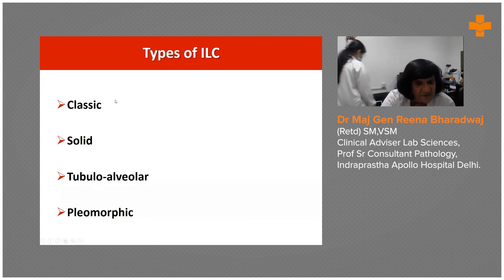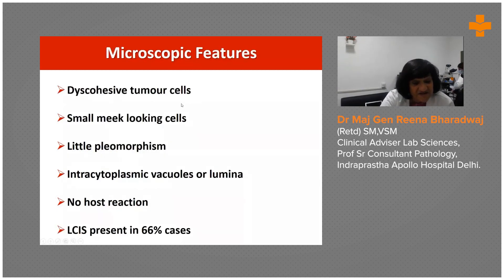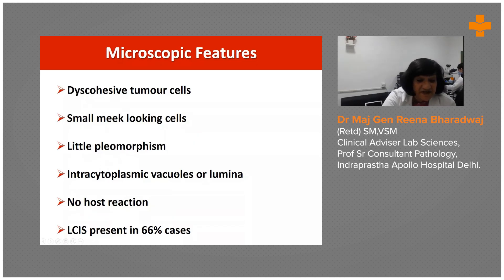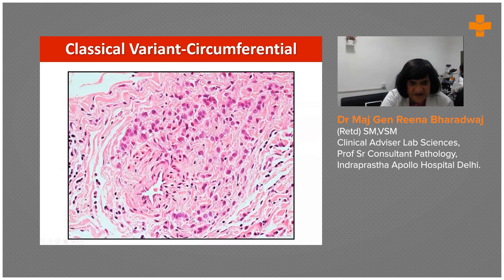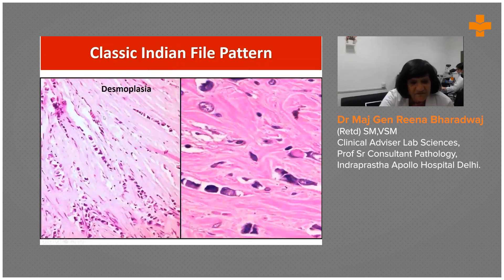The variants of invasive lobular carcinoma include the classical type, solid, tubuloalveolar, and the pleomorphic. They are discohesive cells — small, meek-looking, with very little pleomorphism. They show intracytoplasmic vacuoles and do not produce a host reaction. Typically they don't produce many TILs. LCIS is often present in around 66% of cases. This is the circumferential targetoid growth of lobular carcinoma cells growing all around the ducts — the bullseye pattern.